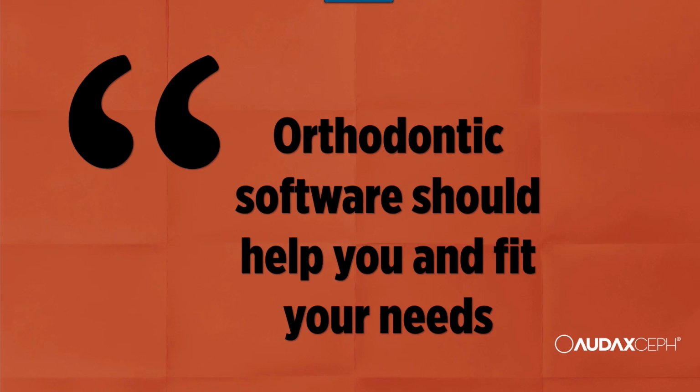You must search for advanced functionalities in software, such as automatic tracing. You do not want to spend hours in front of a computer doing tracing manually if there is a tool which does it for you automatically. Your software must be scalable so that you can start with simple and easy edition of the software, for example, AudaxCeph Super Easy, and later continue to more advanced editions. This also makes your investment into software more safe and eventually in more steps. If you are happy, you can go on.